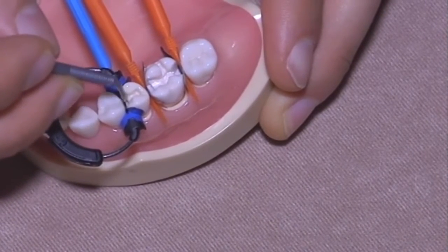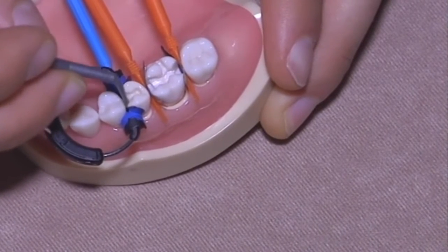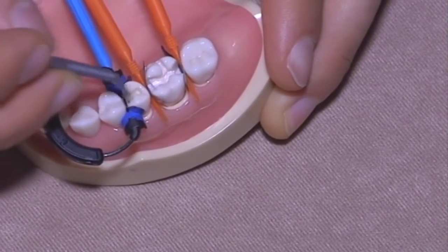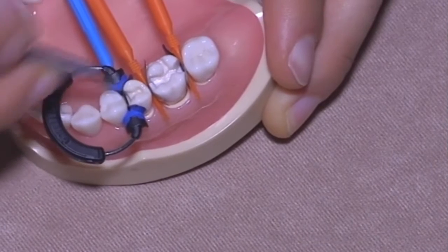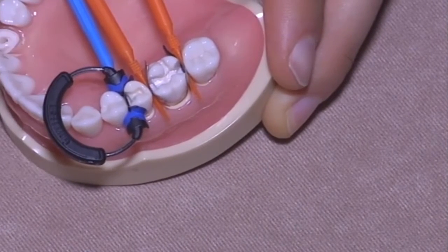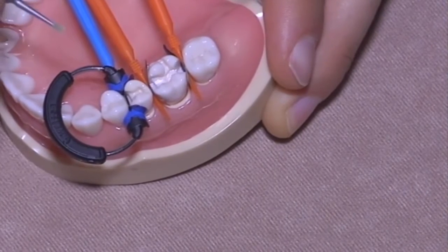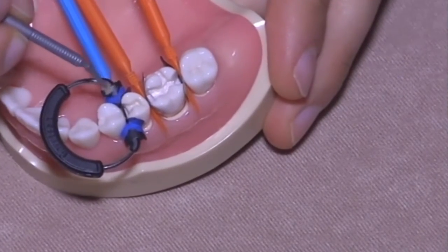It's better to waste 10 seconds more on this step instead of performing the restoration again because the patient is in pain or you have infiltrations. So in this case, you apply your bonding, then you dry it with air. I can blow. Don't do that, really, please.